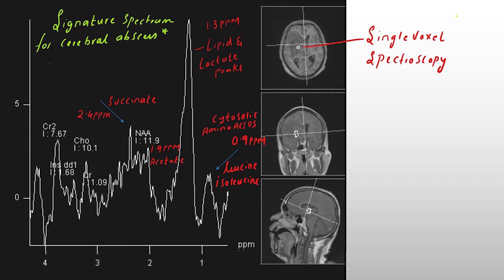This is the spectroscopy. Here you can see a low TE single voxel spectroscopy. There is a large peak which represents a lipid-lactate peak. To differentiate lipid from lactate peak, you need to do intermediate TE at 135 and 144 ms. This largest peak is non-specific, as any necrosis can produce it. You need to look for specific metabolites. There is a peak at 0.9 ppm showing a doublet type pattern, which could most likely be amino acids like leucine, isoleucine, and valine at around 0.9 ppm. Another peak to look for is the acetate peak at 1.9 ppm.